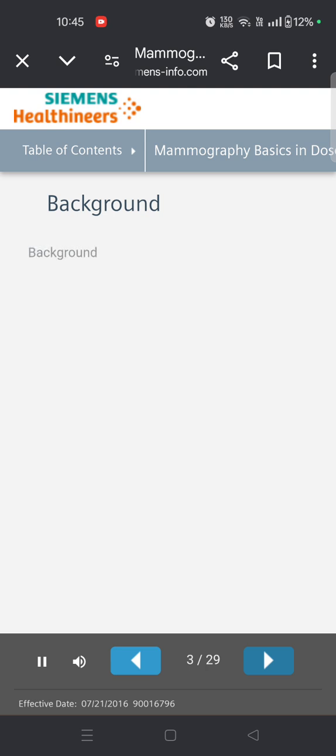The outline of this module is first we will cover some background, then we will talk about radiographic technique and dose, image formation, and finally, image quality. So first we're going to cover some background for mammography.